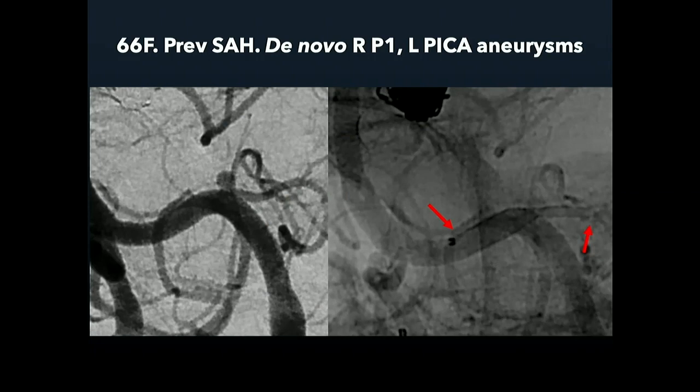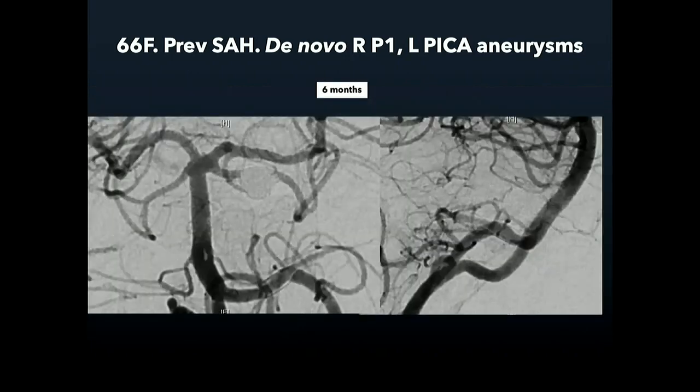And then we turned our attention to the PICA aneurysm, and it actually proved impossible to get into the PICA from below, from the left. So we switched to the right and came down the PICA from right to left, and then delivered the Silk Vista baby there. So you can see it going from narrow and constrained in the PICA to nominal diameter in the vert. And this is the follow-up at 6 months. So both aneurysms are gone, and the stents are nicely patent.